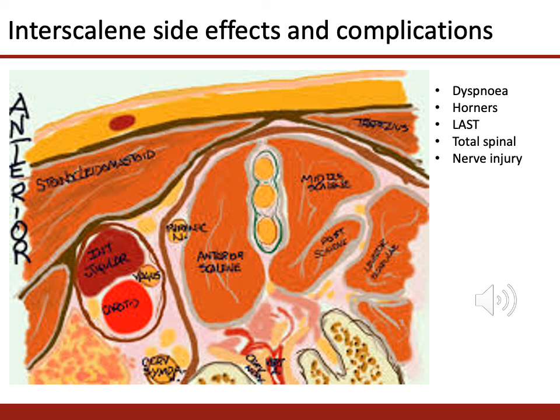With the vertebral artery, if the tip of the needle is not visualized and too deep, and an inadvertent deep injection is given, we can see how stroke could be caused, how we could again get LAST, and a total spinal if the needle actually traverses the dura at this point. It is very rare, but pneumothorax is also feasible.